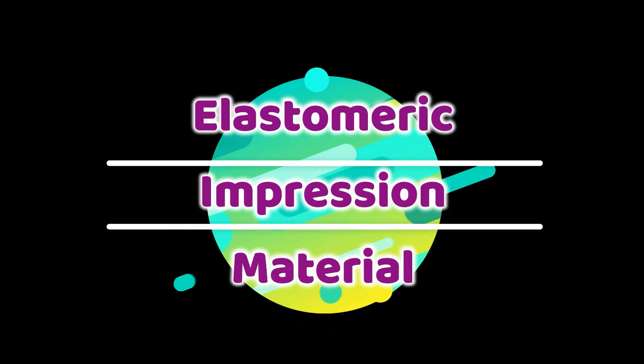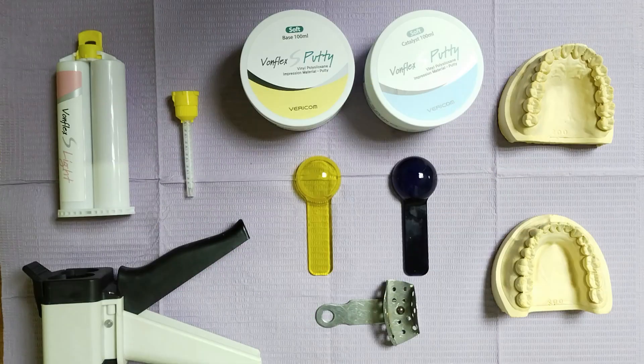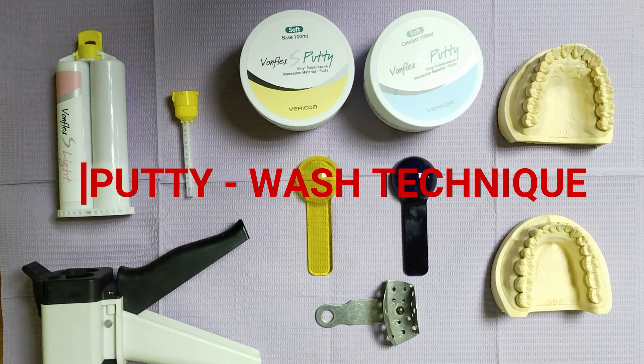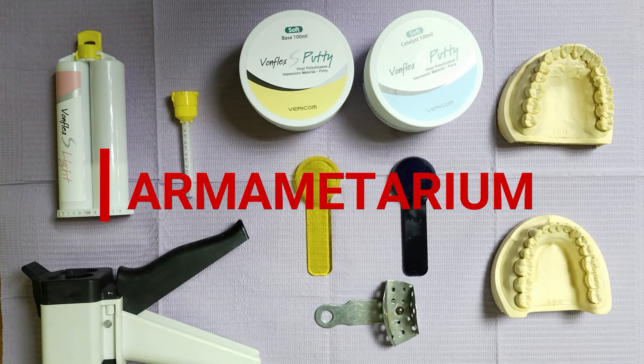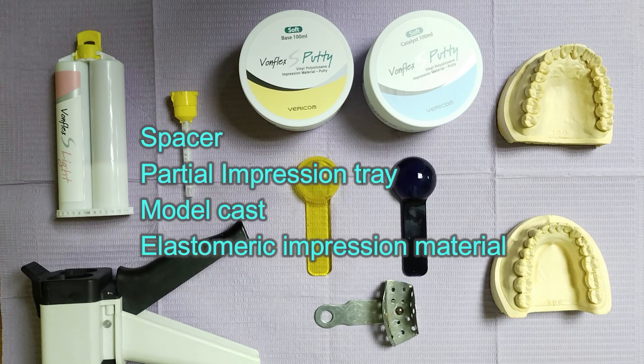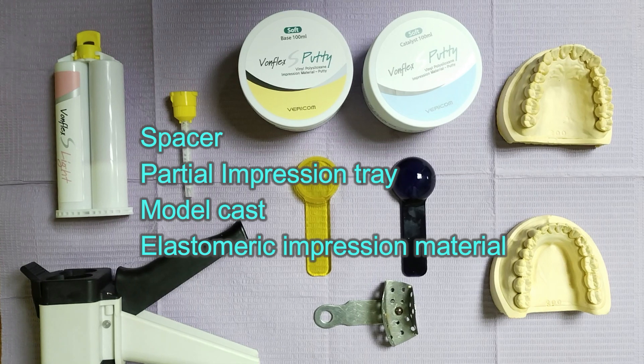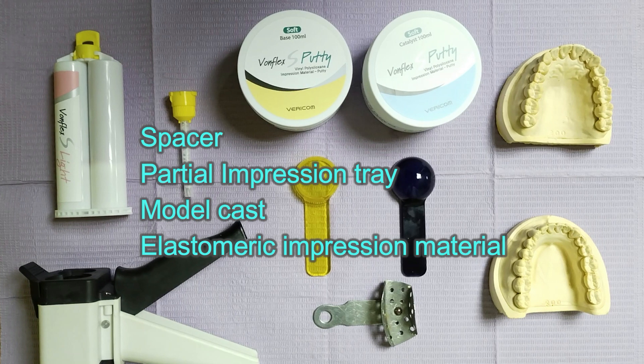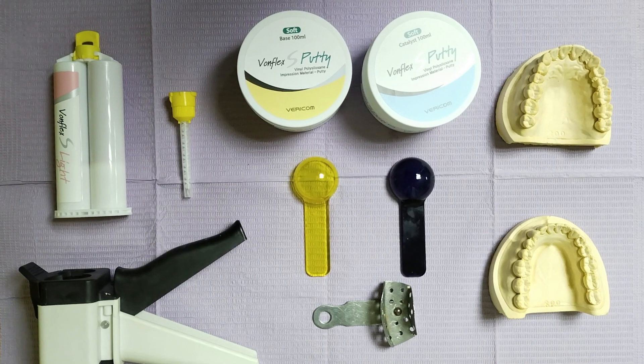Experiment 6: The study of the manipulation of elastomeric impression materials. We will use the putty and wash technique, or the two-step technique. Prepare your armamentarium, which includes your spacer (a small piece of plastic wrap), your partial impression tray, your model cast, and your elastomeric impression material, which contains your putty and light body or wash.